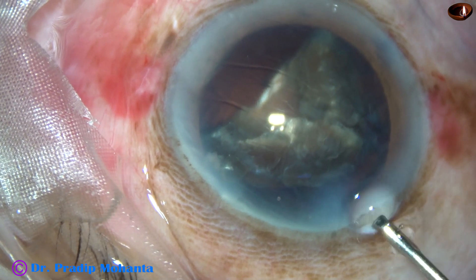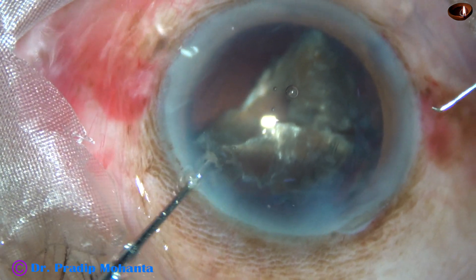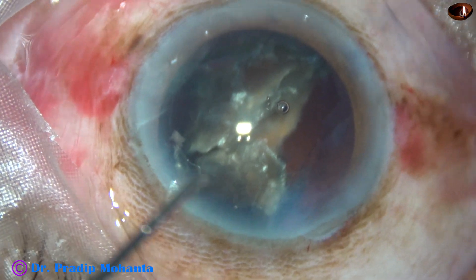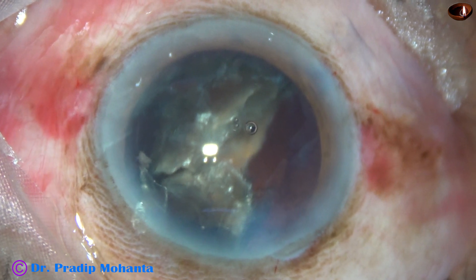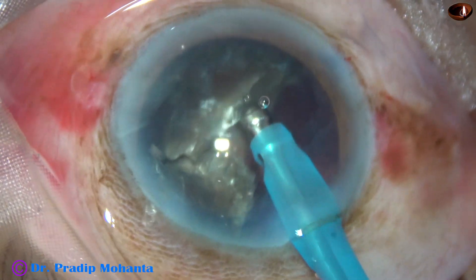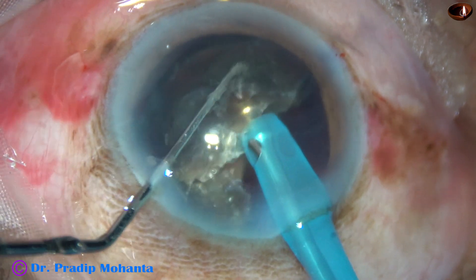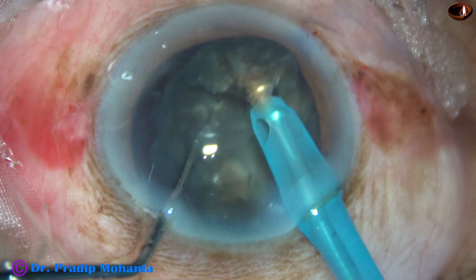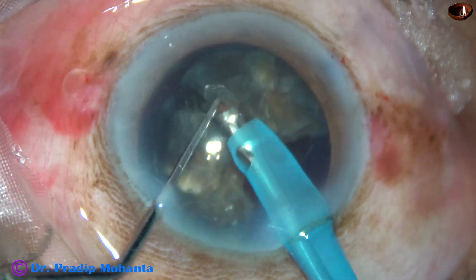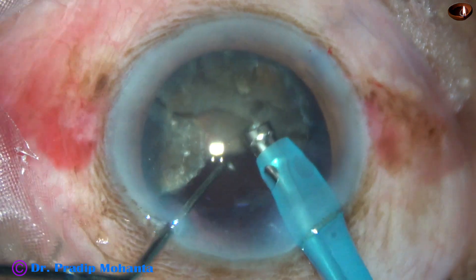Now I come out — I want to protect the endothelium, so I refill the anterior chamber again with 2% HPMC. Frequent application of HPMC is as good as use of Viscoat, which is the chondroitin sulfate and sodium hyaluronate combination. Now I go again with the phaco needle. My plan is to divide this remaining portion of the nucleus into three parts — this is one part, and these are another two parts. All these portions are attached to each other by a leathery posterior plate.